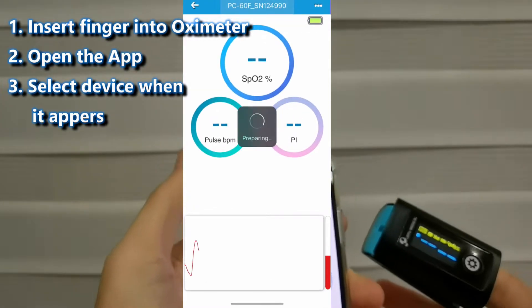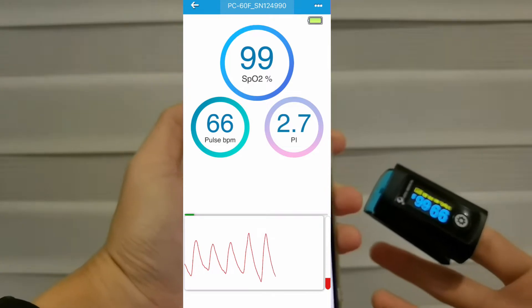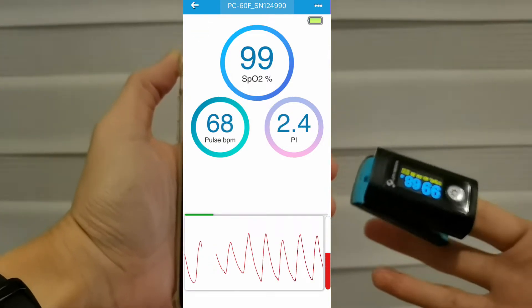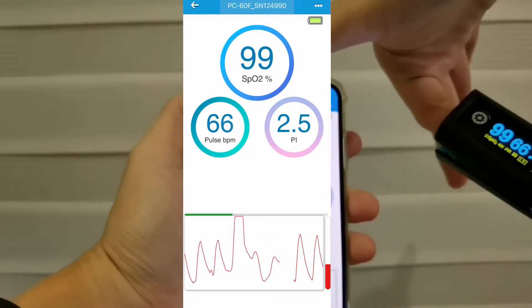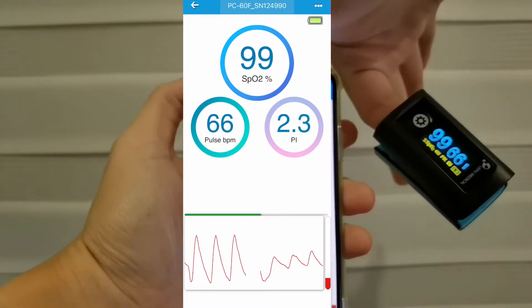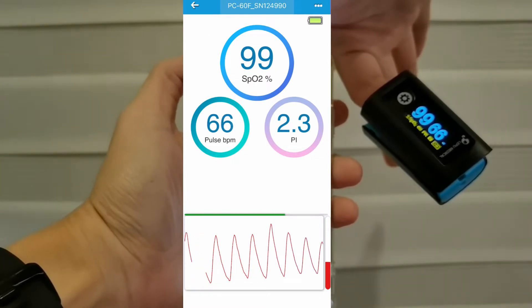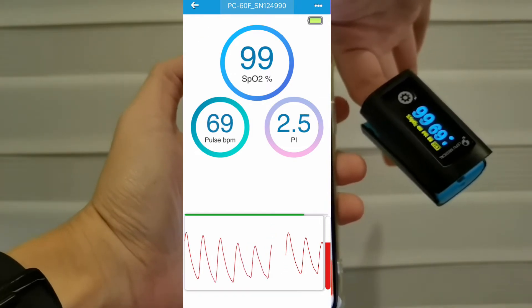You can see the recording right now. In my opinion, I don't think you need to use this app because there's not much you can do with it.